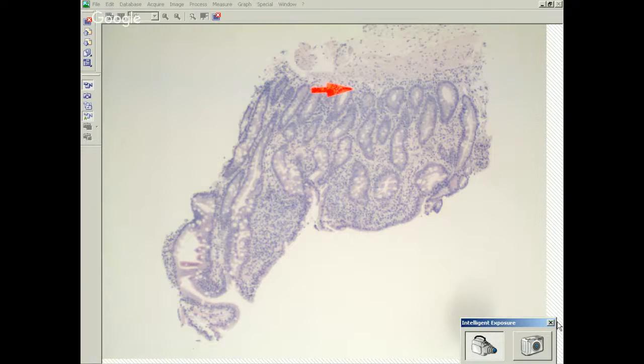Okay. So I saw a lot of information. In the epithelium and also the lamina propria. To me, the villi are kind of blunted and big. Right. So you hit on a lot of the points here. There's intraepithelial lymphocytosis. There's some expansion of the lamina propria with chronic inflammatory cells, and I think there's a couple of neutrophils in there as well. You mentioned that there's some villus blunting that's also seen. So here, what would your differential be?